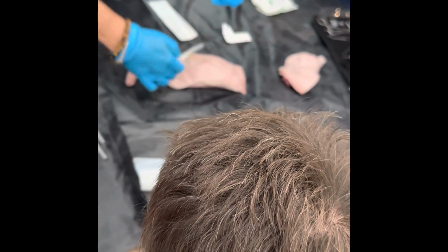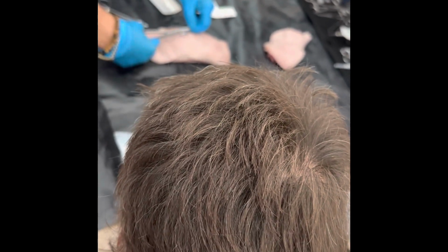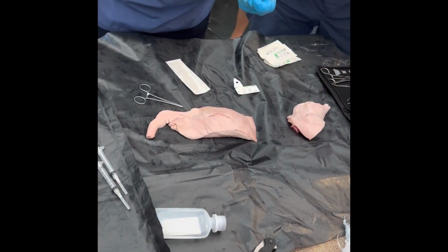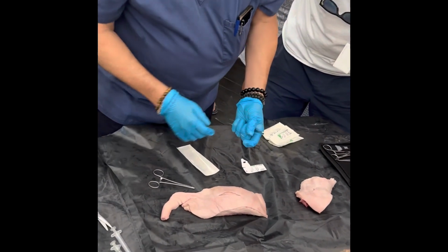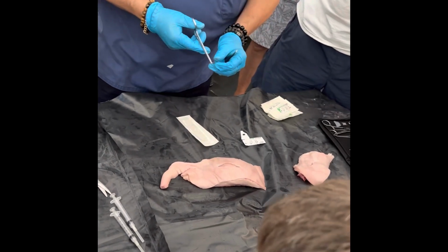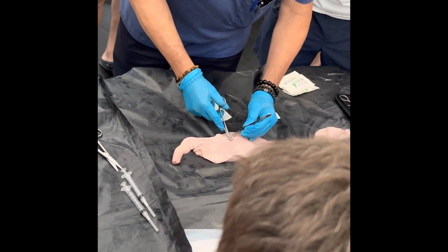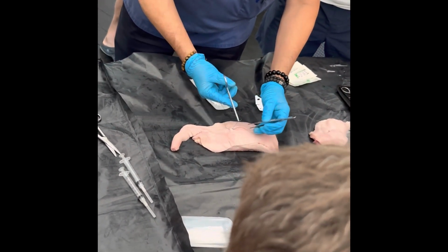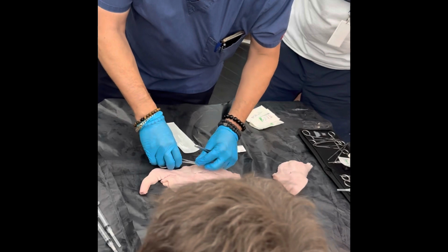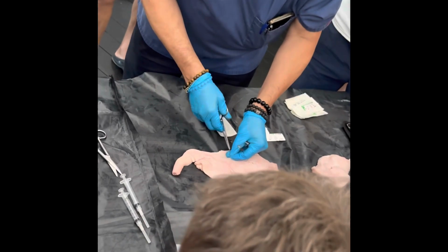Yeah, let me do it this other way. One of those days you can't see anything? Yeah, the lighting's not exactly ideal here. All right, one of the things that's really, really important, remember the other one that we did? You might not actually do it as fast as I do. Okay, you grab on, go in, pull out, tie it. One, two. Very small area, and we do a little loop.